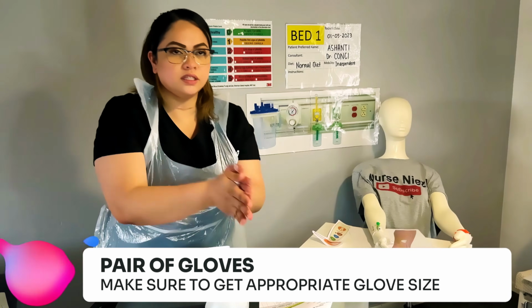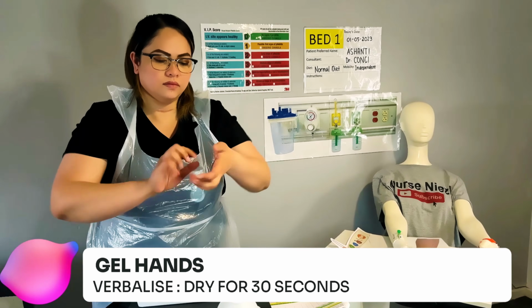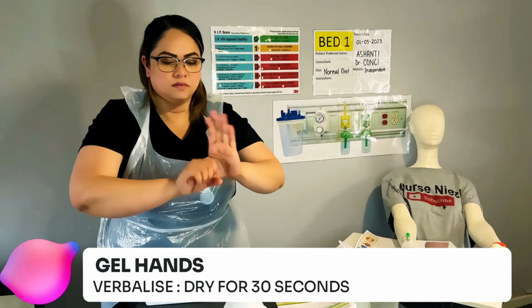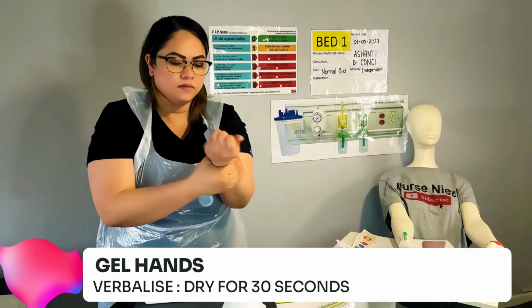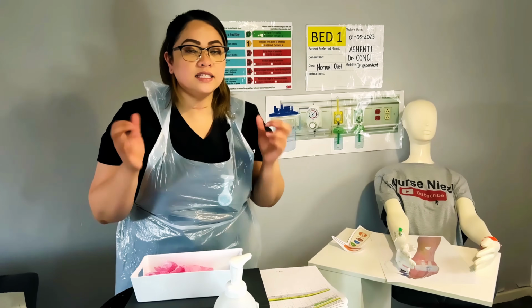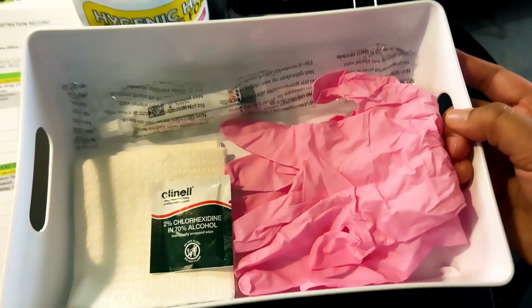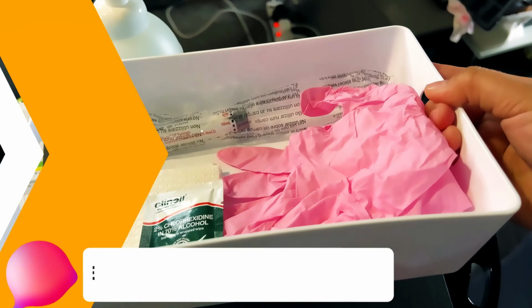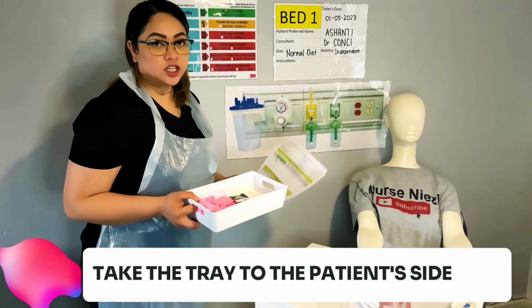Okay, let me just gel my hands. Let it dry for 30 seconds. I'm now going to go to my patient. So I'm going to go now to the patient side. So take the tray together with the prescription to the patient side.